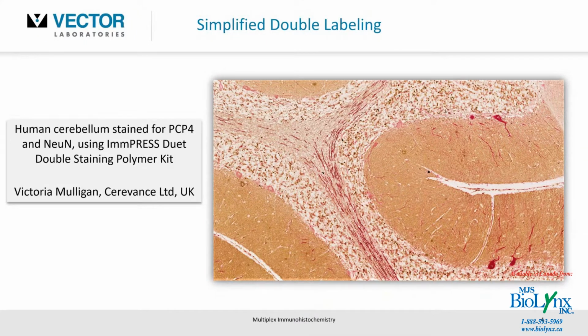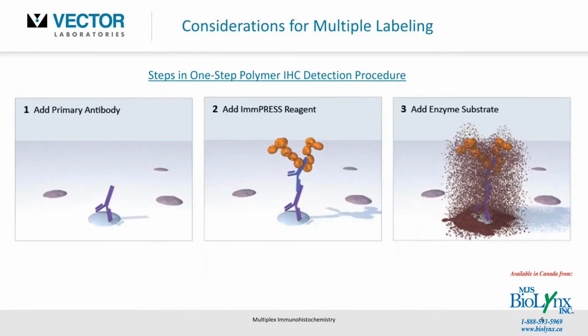So have a look at those, the clear demarcation or contrast between those two antigens. See if that's something that might also be applicable in your given application. However, I'm certainly aware that biology is not as black and white as that, and there's a lot of gray areas. Indeed, different primary antibodies could be raised in a goat, rat, things like that.